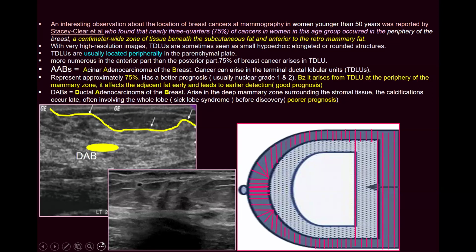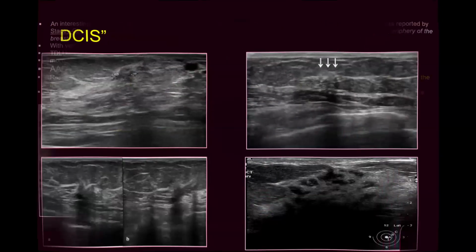I suggest that probably, and even now the illustration, these pink lines are mine to make it a little bit beautiful, not just blue. That is for you, to make you happy. Let us go to the next slide.